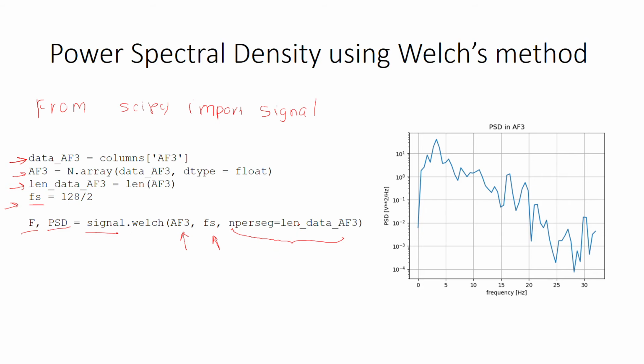In our previous slide, I told you that 4 seconds could be the minimum, but in this case you can use a window size of the whole length of the recording. So you need to cover the whole sequence moving through time. The result will give you something like this.